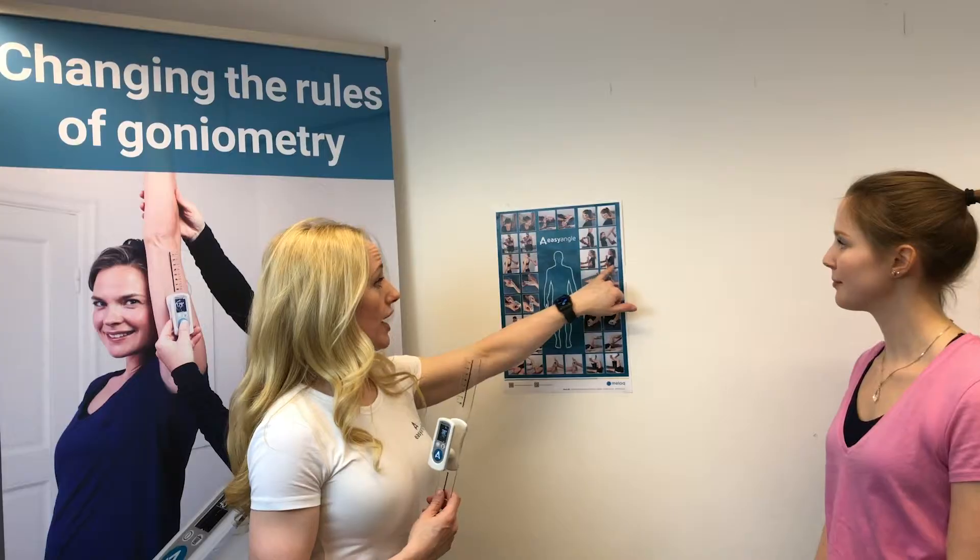We simply have the device measuring the angle. This is demonstrated on the poster right here on the right side, just below the shoulder flexion.